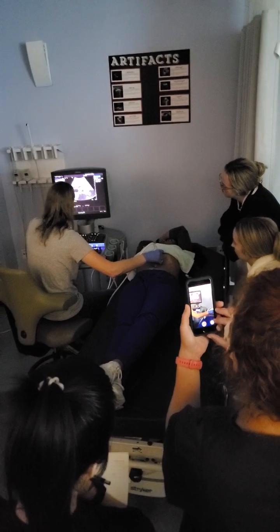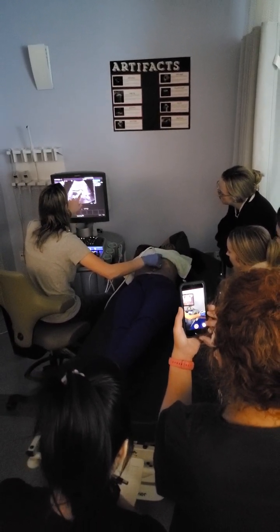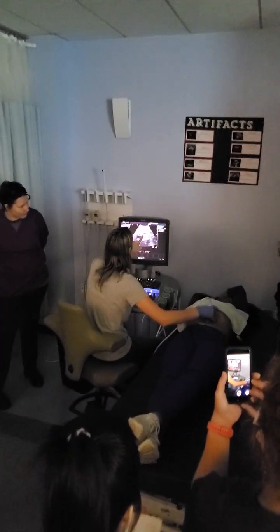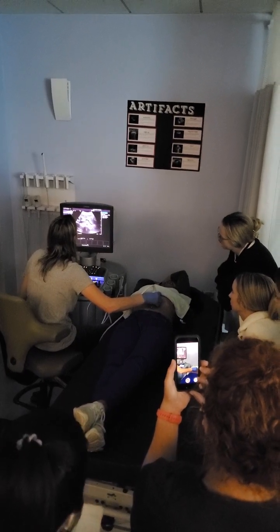So we see our pancreas somewhere. So here's our portal splenic. So SMA, aorta, IVC. So this is that splenic vein we're not seeing too much of, and I'm in true transverse right now, going into that main portal vein. So we like that 10 o'clock for that main portal vein to open them up. So now I'm just going to rotate to 7 o'clock, and there's my pancreas.